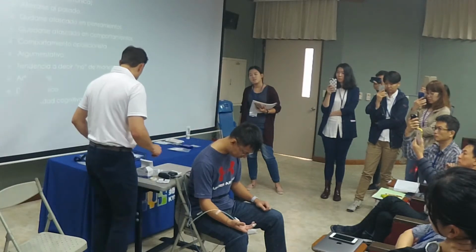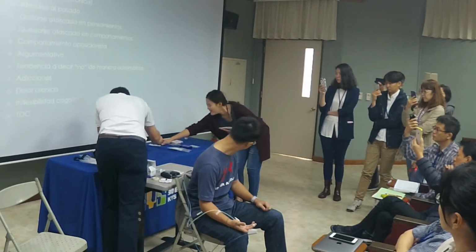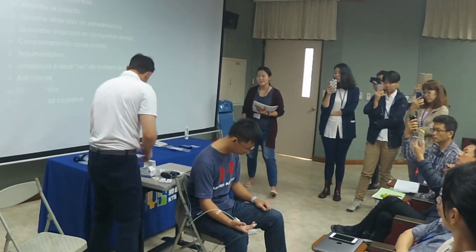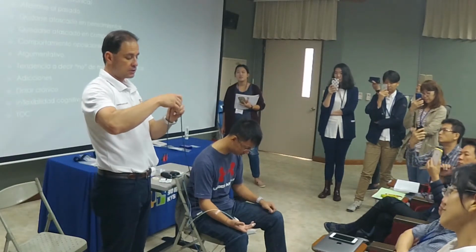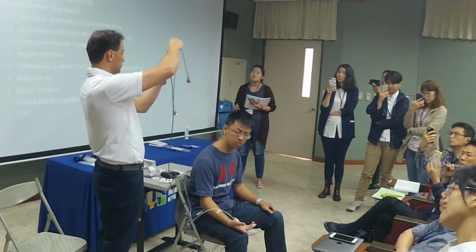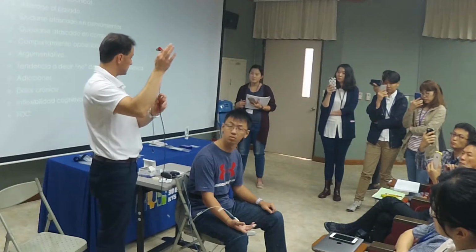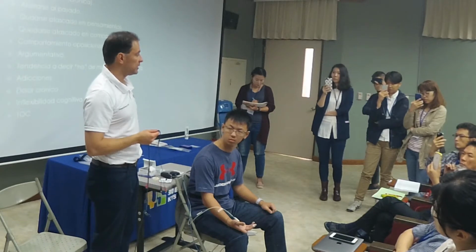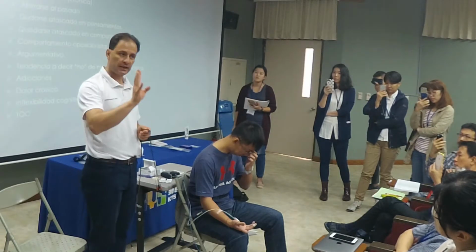All right, so again, we're going to use this. You're going to see this has two channels. They're going to be labeled channel 1 and channel 2. This is one of the things you have to be careful with. So it's 1 with a red lead and a black lead, and 2 with a red lead and a black lead. Okay, so 1 is going to be your active sensor. The other one's going to be your reference sensor, just like neurofeedback. 1 active, 1 reference. Okay.